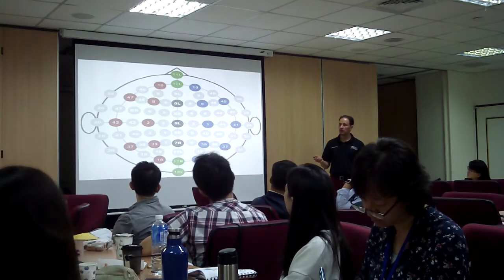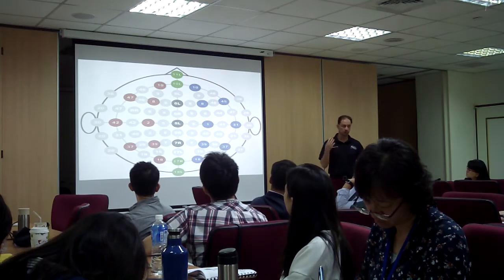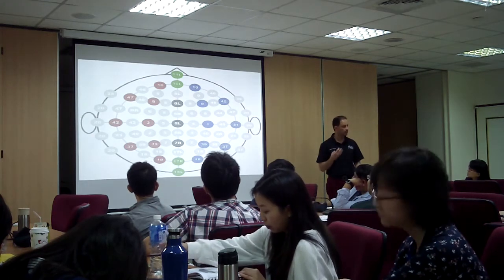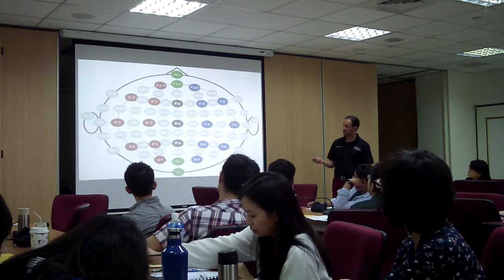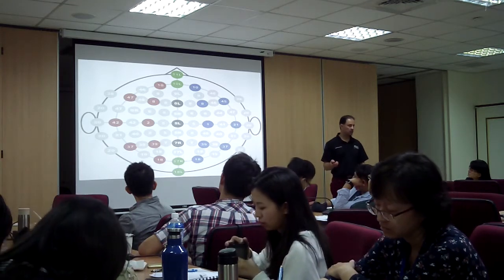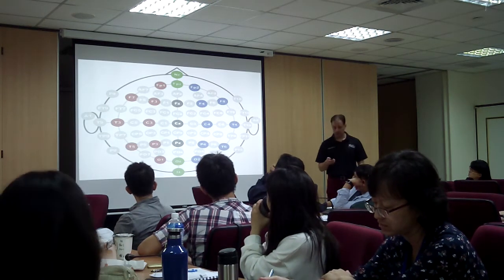And I'm going to send you also one that talks about medication and the EEG, so what medication does what to the brainwaves, and different ones that you can have, which are free distribution that will help you with your reading material. So we use the 10-20 system and the Brodmann areas as the basics, as basis for our training and intervention, because that's how we know where to place the sensor and what functions we want to optimize.